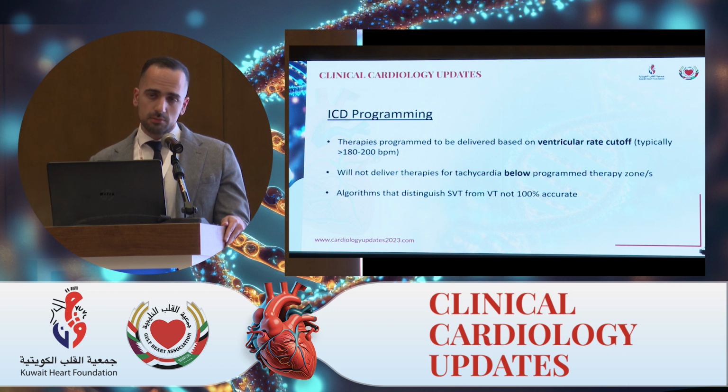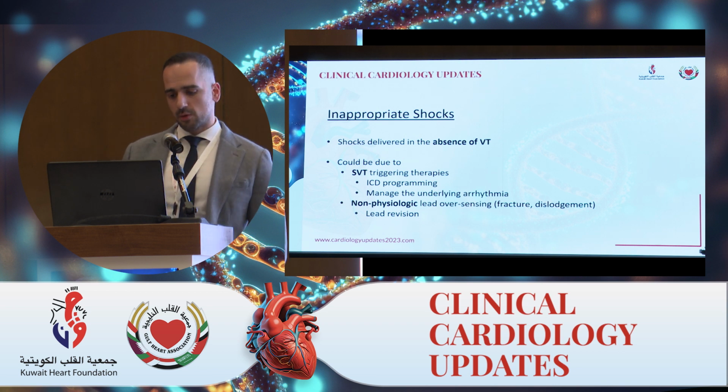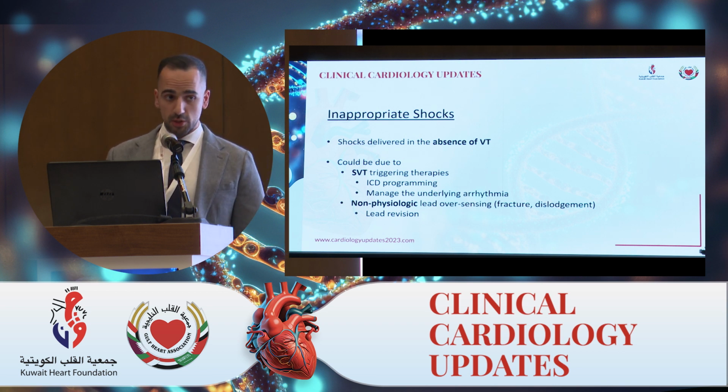However, as you know, not all tachycardias are ventricular. Supraventricular tachycardias can also approach those rates. And while most of these devices do have algorithms to try to distinguish SVT from VT, and the presence of atrial leads can also assist, at the end of the day, it is the rate that is going to determine whether the device will shock the patient or not, and nothing is really 100% accurate. And that brings us to the concept or the theory of the problem of inappropriate shocks.